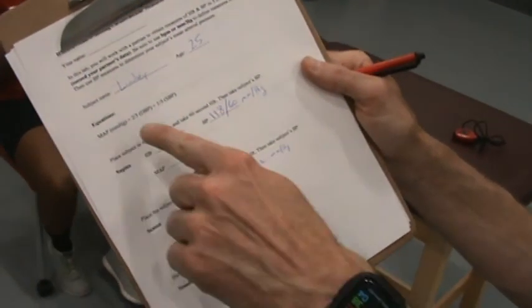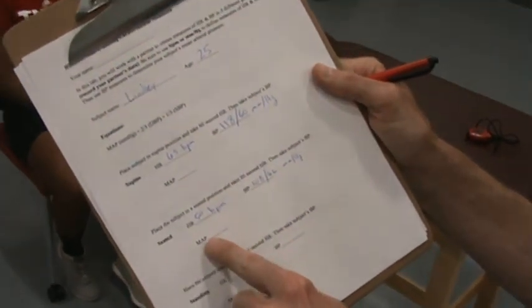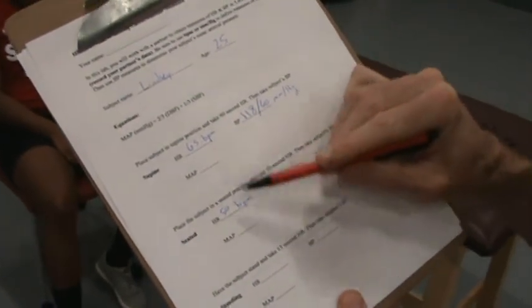Okay, so once we have her blood pressure measured, again, you'll calculate the mean arterial pressure by plugging these numbers into the equation here and putting your mean pressure below. Okay, just looking at how similar these numbers are, your mean arterial pressures will probably be pretty similar as well.